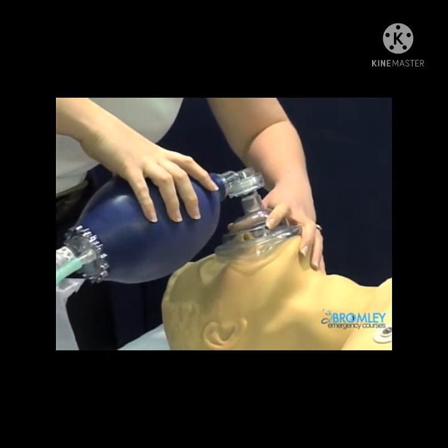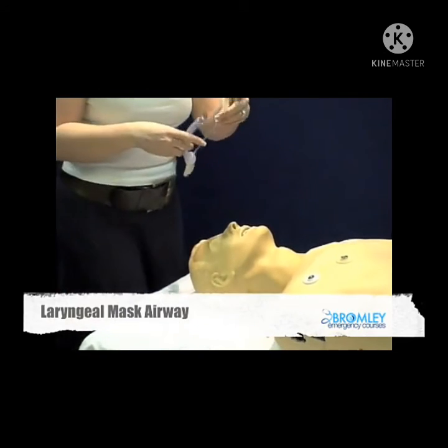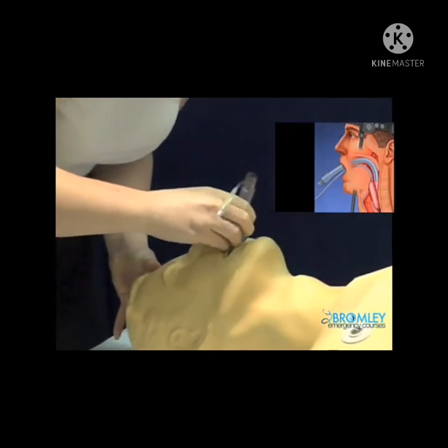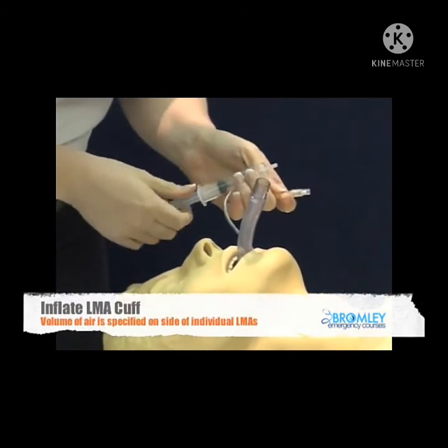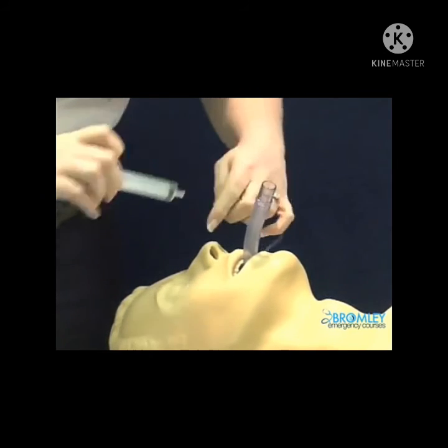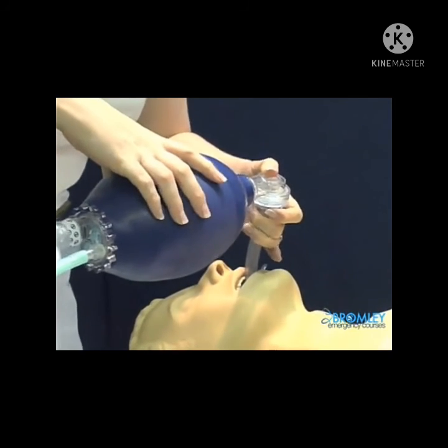A step before an ET tube would be using, we have here a laryngeal mask, which you hold like a pen, and really you just push it down to insert it until it sits comfortably. You then need to inflate the cuff. Usually this causes the mask just to raise slightly out of the mouth. And then you ventilate, again using the bag valve mask.